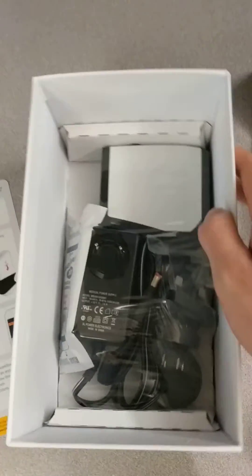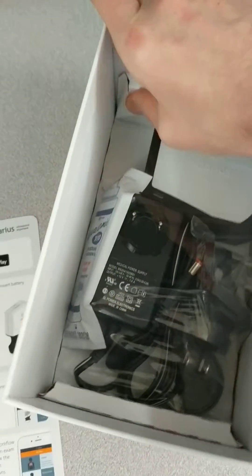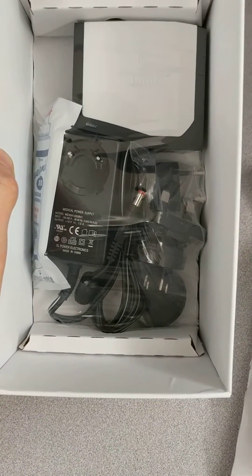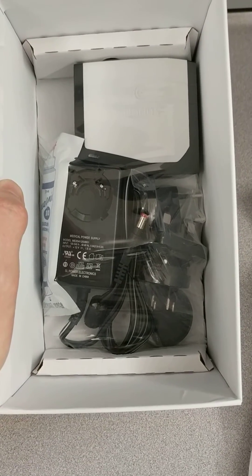And beneath it, I guess this is all just the charging. It's actually in there really nice and tight, so basically it's just all of the charging equipment so that we can just set up and get going right away. Cool!